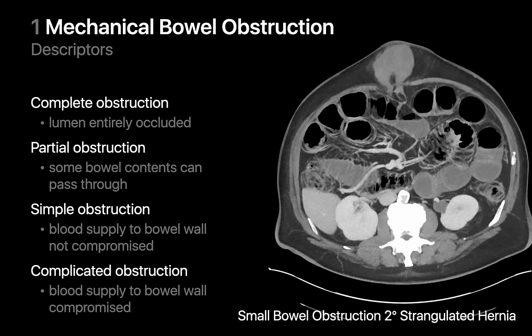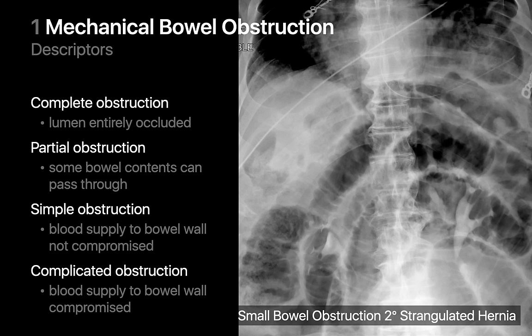Here's an example of a strangulated hernia on CT, where a short segment of small bowel became trapped in the anterior abdominal wall after passing through a small defect in the muscular layer. Due to the small defect size, the afferent and efferent small bowel segments have become obstructed. Bowel obstructions where two points along a segment of bowel are obstructed at a single location are called closed loop obstructions — in this case, the small bowel segment trapped in the anterior abdominal wall superficial to the muscular wall.